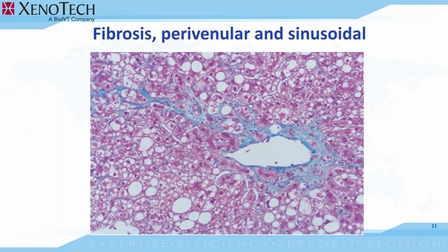Fibroblasts traversing the hepatocytes in zones, in this case 3 and 2, represent sinusoidal fibrosis. You see that individual hepatocytes, regardless of their individual health status, are surrounded by elongated fibroblasts or bands of collagen.